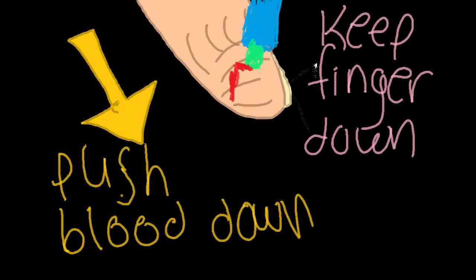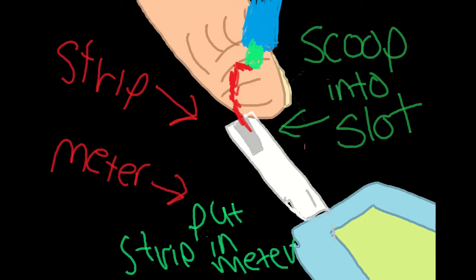Okay, now you are going to hold their finger down and use your gloved finger to push the blood downward to allow it to leave more easily because of gravity. It's a great thing. And then when the blood leaves, you will be using that to measure their blood glucose reading. So that test strip that we didn't put completely into the meter, you can put it all the way in now because we're ready to use it, so we don't have to worry about it timing out.